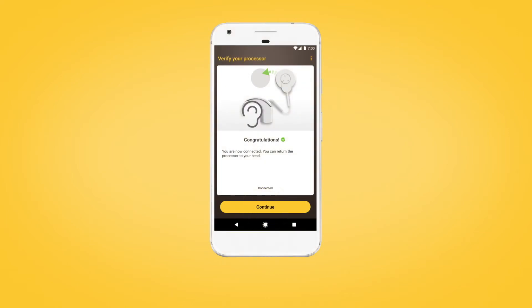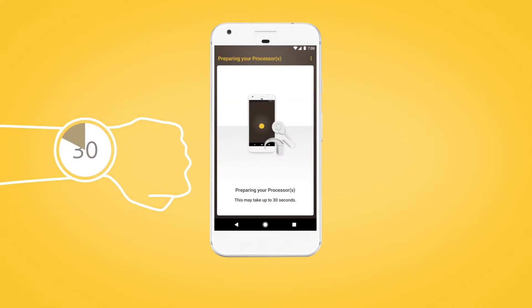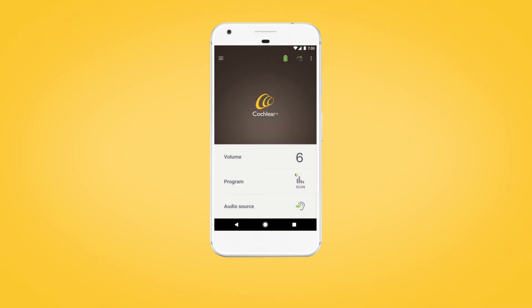Tap Continue to begin preparing your processor. This may take up to 30 seconds. When setup is complete, select Continue to begin using the Nucleus Smart App.